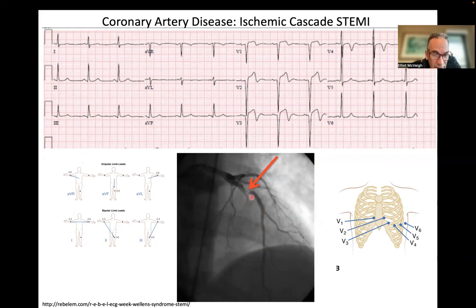So blood is getting through there, either through this mechanism or another vessel is filling this vascular tree in a retrograde way. Highly unlikely with this much contrast here that it came back up in a retrograde fashion.